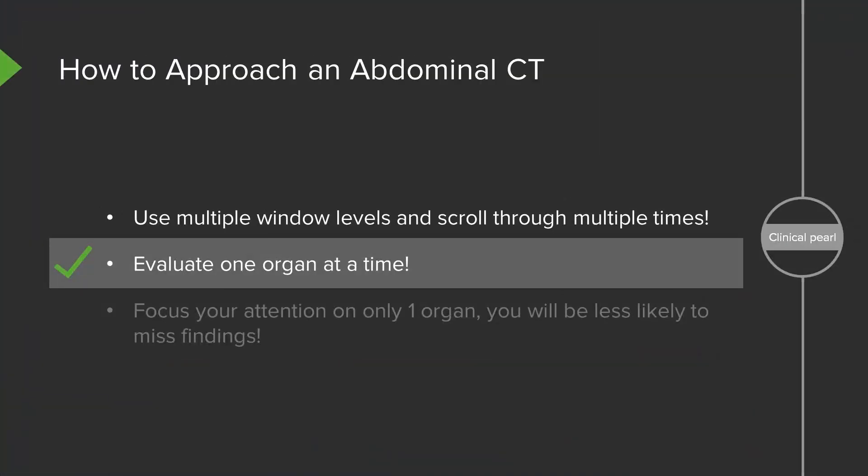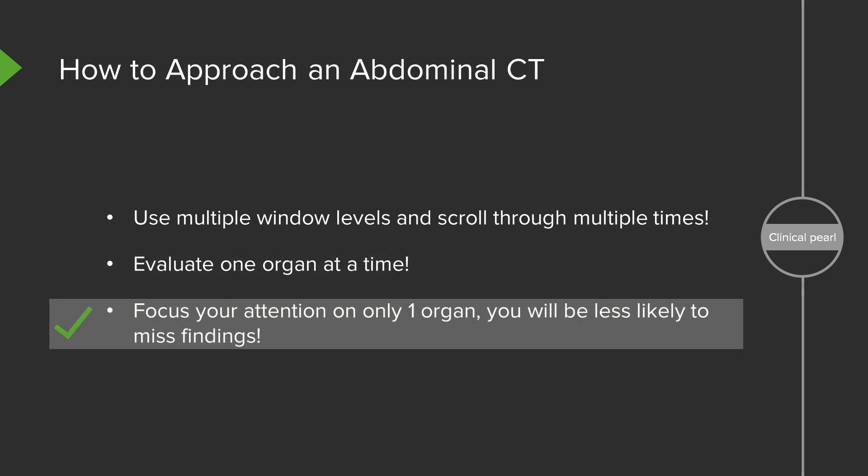It's important to evaluate only one organ at a time. The abdominal CT scan has a lot of different organs, and if you try to look at everything at once, it's very likely that you'll miss something. So it's important to take a look at one organ at a time and scroll through multiple times through that organ before moving on to the next one. By focusing on only one organ, you'll be less likely to miss findings.